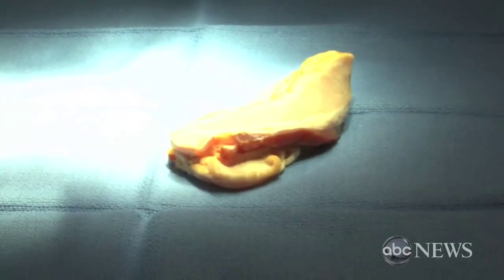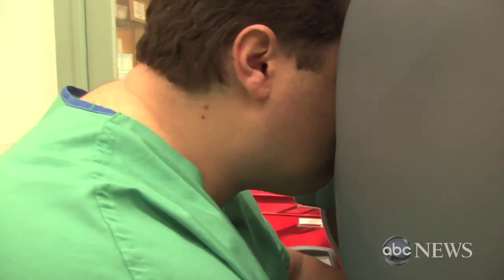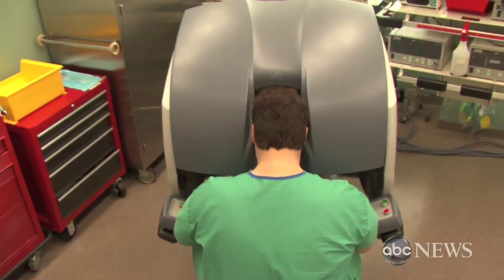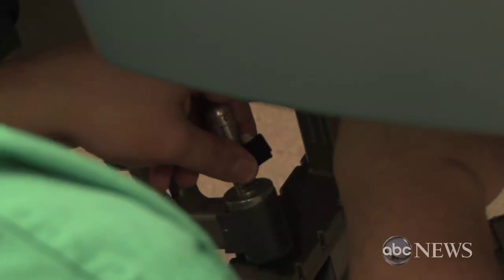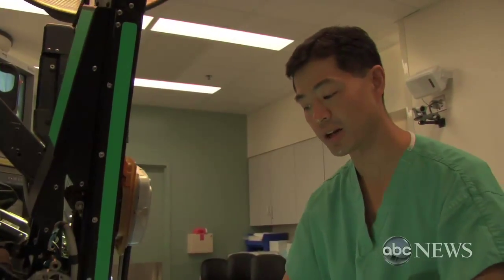Joe has watched me do this procedure several times, so he's got an idea of what to do. But it's never the same as just doing it. This is the DaVinci robot — it came into widespread use about five years ago. It's a new frontier in surgical technology. We're just going to practice this because this is something you can only do once or twice — you don't have more than a couple of chances to do it, and it has to go right the first or second time.